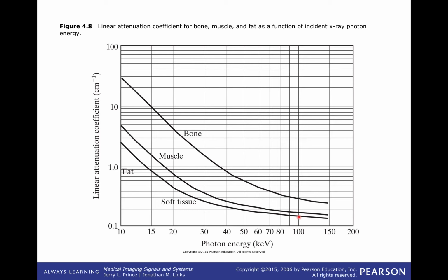In the past decade, essentially CT used to always be done around here at 120 keV because X-ray tubes were built that way. That's what they put out. But now that we have a whole new generation of tubes that can give you 80 keV peak beams at really high mA, like 1400 mA at 80 keV, you still get stuff coming out of the back of the patient because you have enough going in the front side. But they are at a lower energy, and so it turns out the dose is much lower to the patient. And one of the things we don't do in this course is actually a detailed computation of dose, which we don't really have time to do, unfortunately.